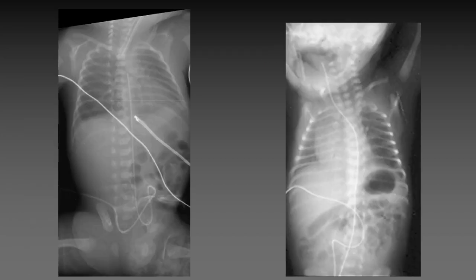Here are two examples of malpositioned UA catheters. The tip of the first catheter is near the ductus arteriosus. The second catheter is high in the right neck at the level of the common carotid artery. Both catheters are too high in position and should be repositioned.